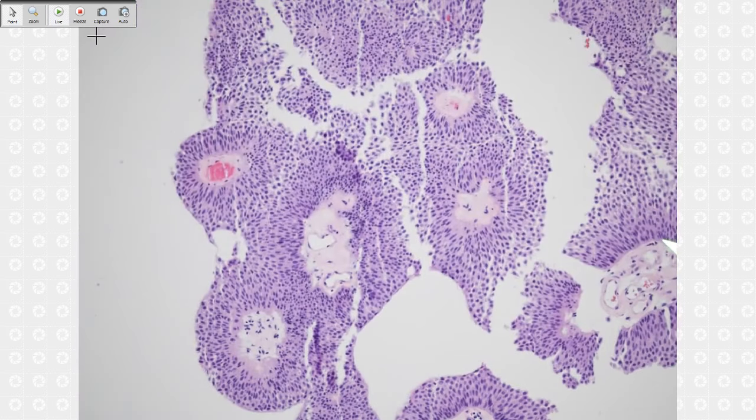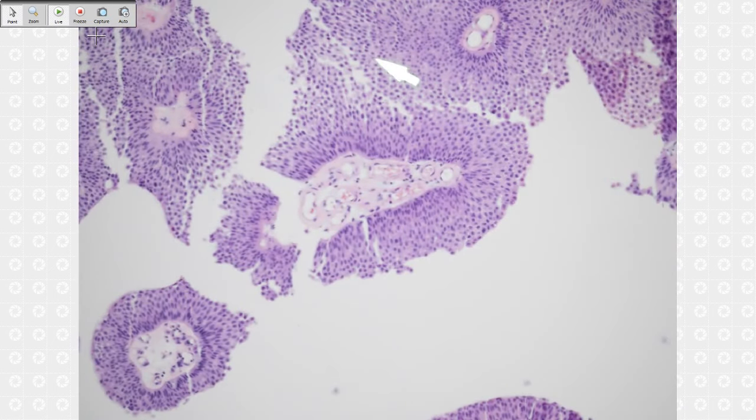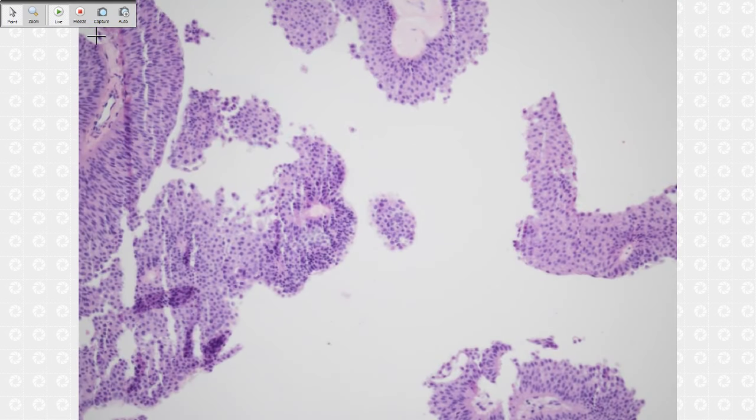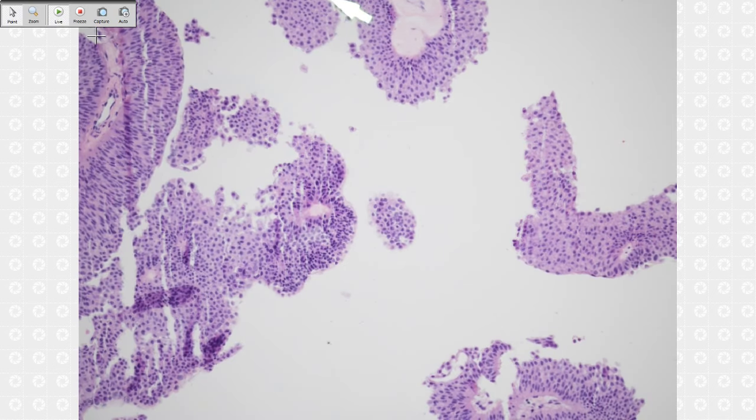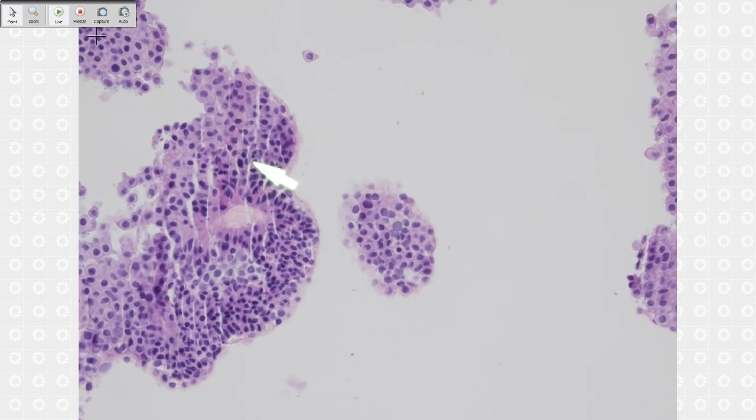You start to see some areas of papillary fusion, right? Here, papillary fusion here. Even here, you see loss of polarity. It looks like the cells are not tightly held together, like a loose adhesion is starting, the cells are spreading. You see here, this cell started to spread. You see definite urothelial atypia here. You see even the nuclear membrane starting to be irregular, right?